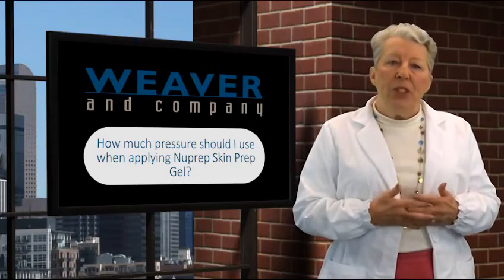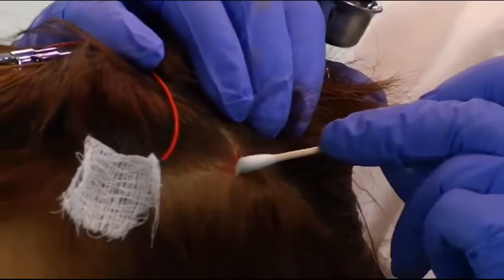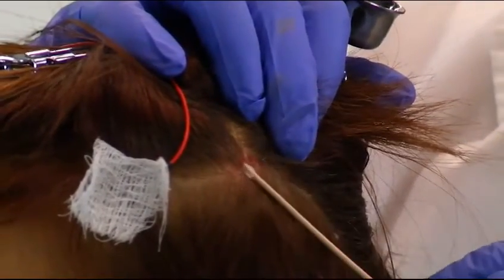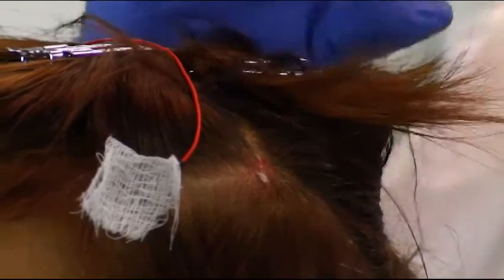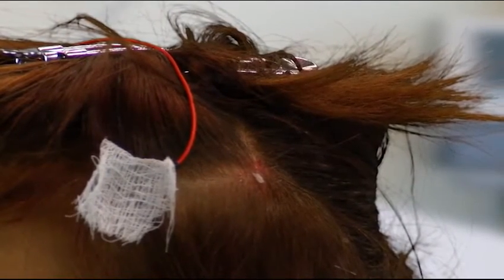Here's a question we get asked: how much pressure should I use when applying Nu Prep? When you're using the Nu Prep, press about as hard as you would if you were filing your fingernails. Then just put a little dab of paste on the spot. This marks the area so that you can turn away and not lose your place as you do the next phase.